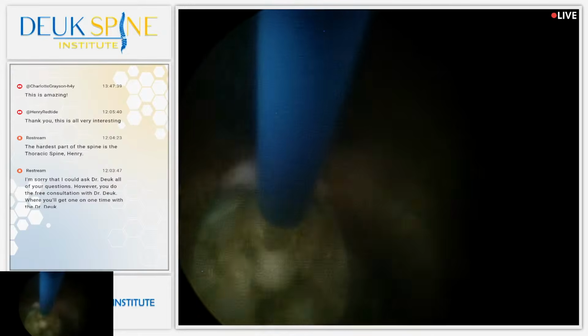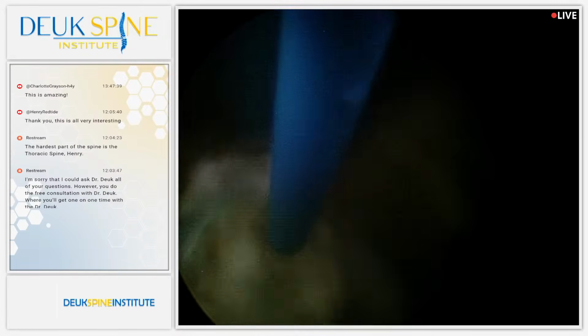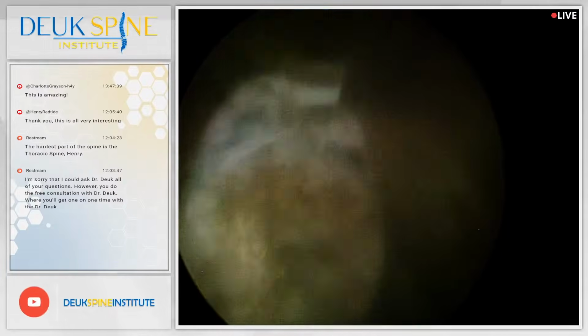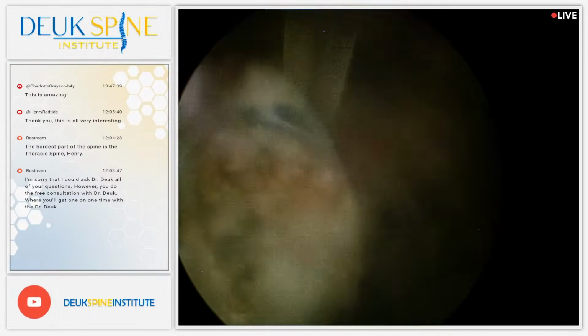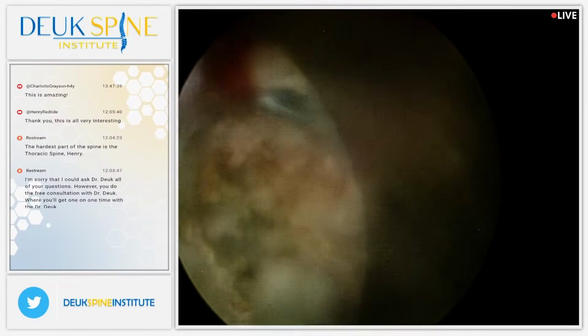You can see from our video that the disc injuries like herniated disc, bulging disc, ruptured disc, protruded disc, slipped disc, disc bulge, disc herniation, those are the number one cause of back pain. And the way they cause back pain is through inflammation. So we are removing that source of inflammation right now at L5-S1 to get rid of their back pain.